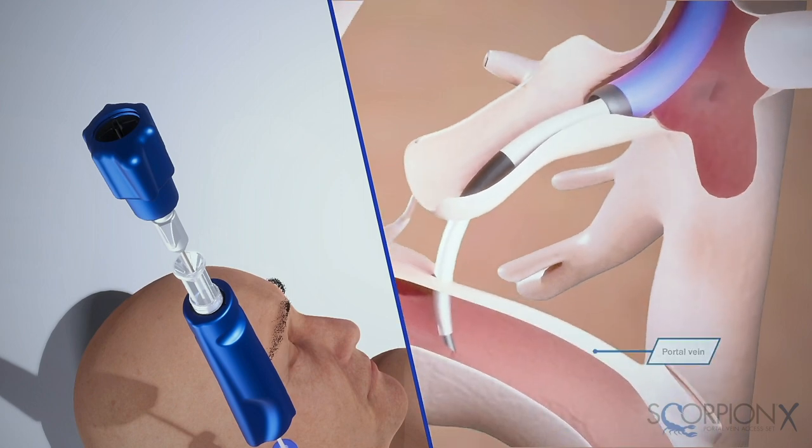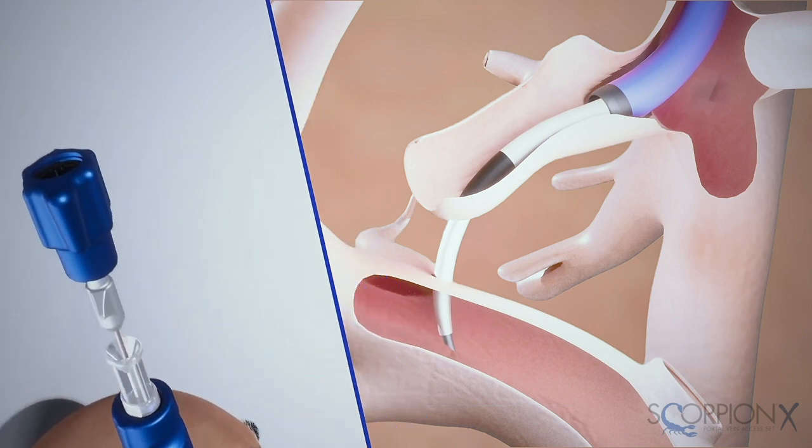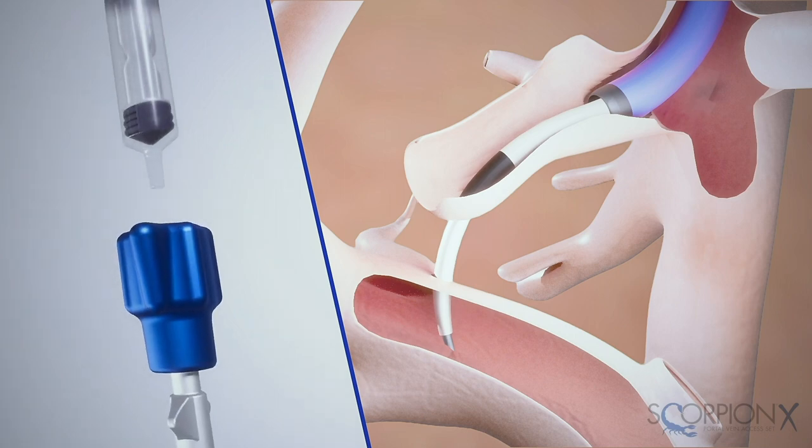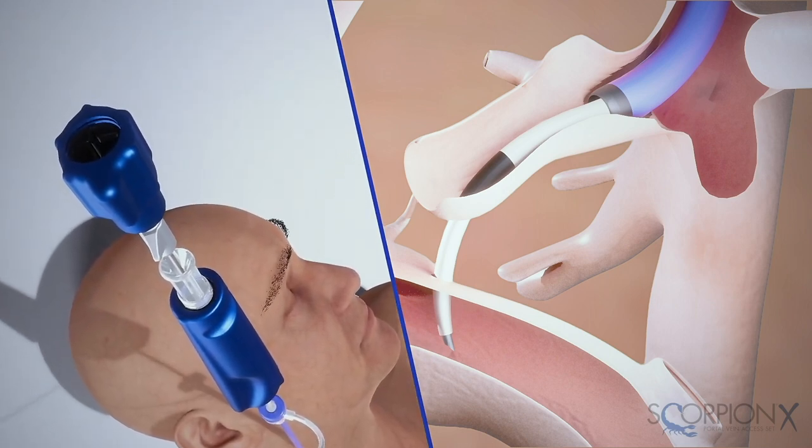After you've reached the portal vein, attach a syringe to the needle handle and confirm portal vein access by withdrawing blood. When confirmed, remove the syringe and place a guide wire immediately into the main portal vein.